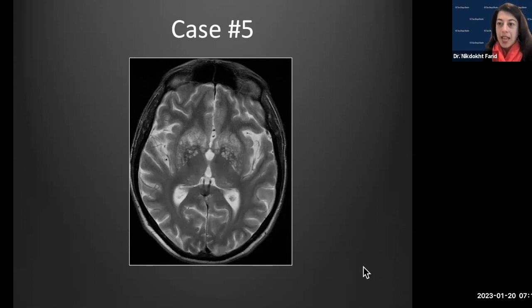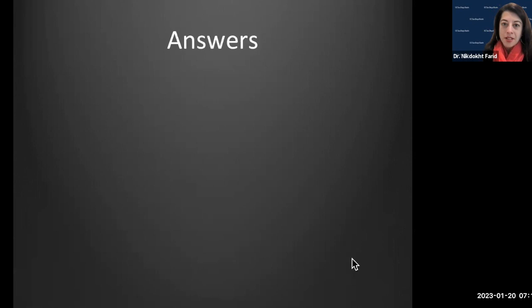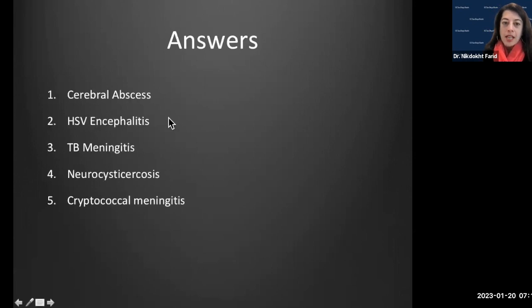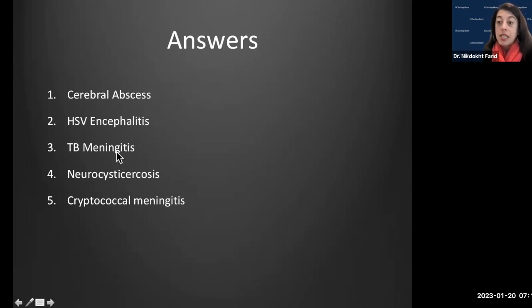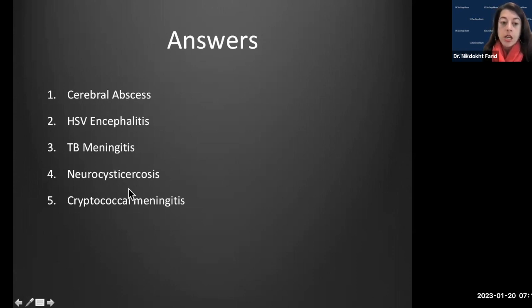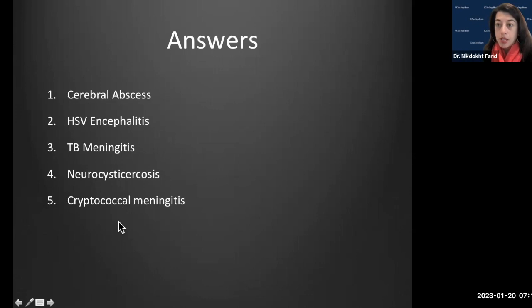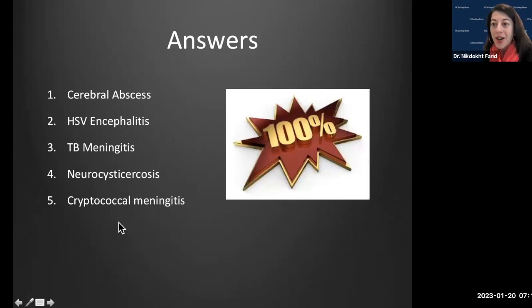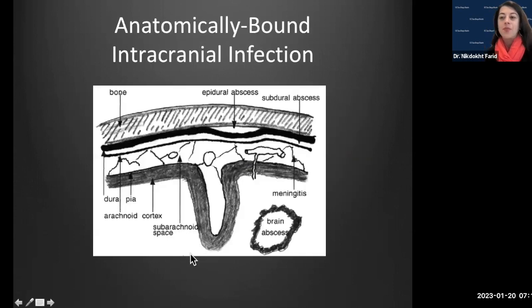The answers: case one was a cerebral abscess, case two was HSV encephalitis, case three was TB meningitis with a differential for fungal meningitis, case four was neurocysticercosis, and case five involved the basal ganglia — consistent with CJD.